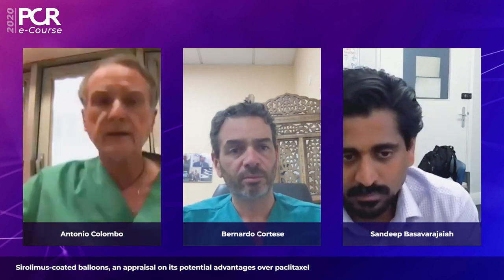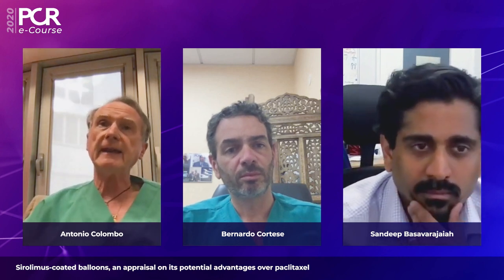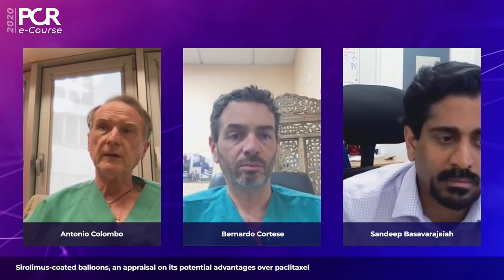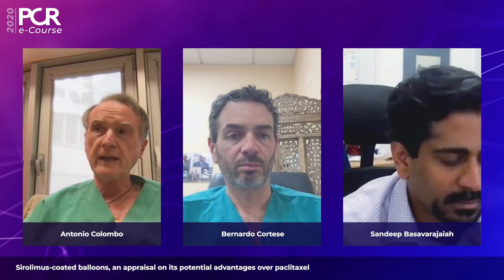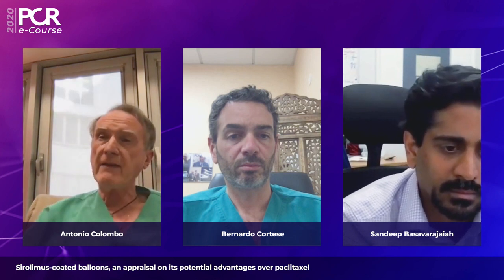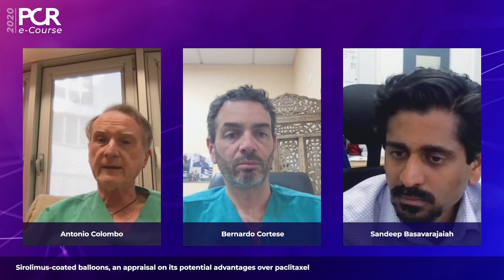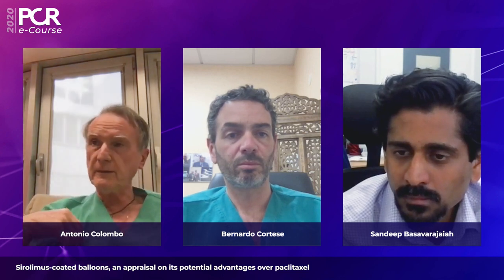Okay, so what can we take home from this symposium? I would say that in-stent restenosis is still a main area where you should utilize drug-coated balloons, because you should try to avoid placing another layer of metal. Nevertheless, you cannot dismiss optimal lesion preparation, and I would say almost every case of in-stent restenosis should be evaluated with IVUS in order to determine if you have inadequate stent expansion. I think examples were shown in this symposium.